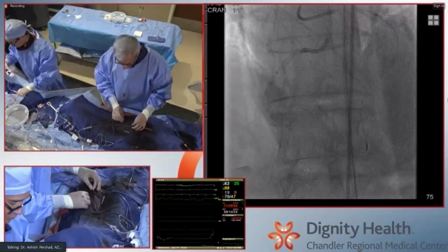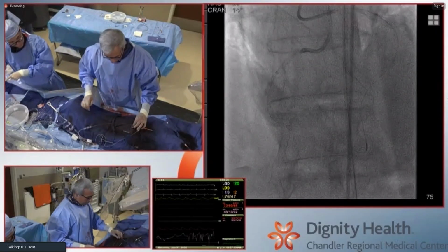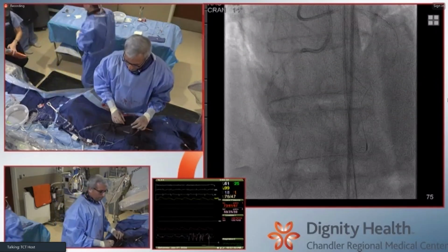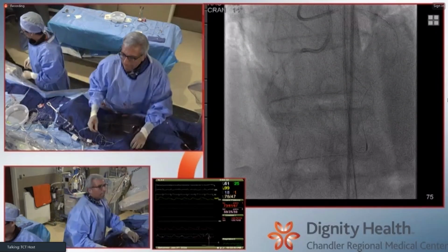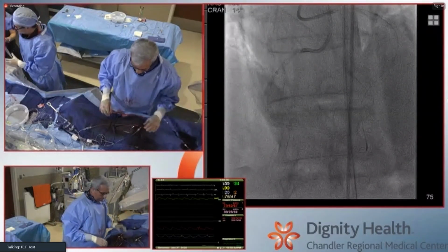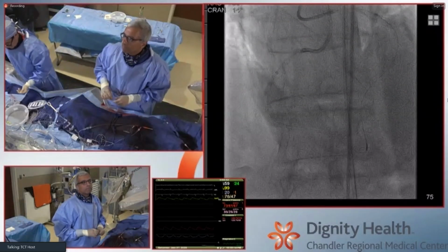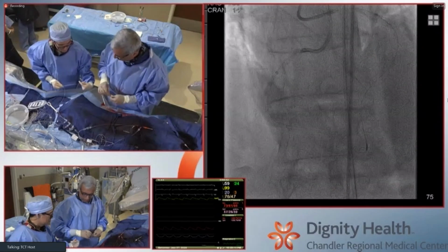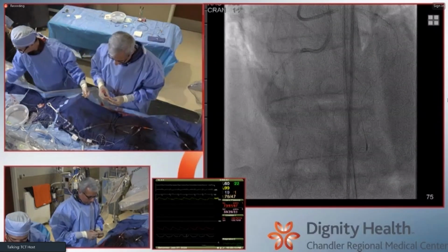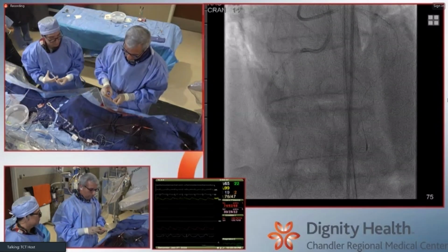there's nothing in here that's going to require IVL or really aggressive therapies within the CTO segment. Proximally, maybe, but we haven't really seen that in all that much detail yet. And frankly, IVL in this scenario, I'm not sure it's going to be all that helpful because you've got a very distensible side on one side. I think the simple, straightforward strategy here is the NC balloon, what has been taken, which is a simple long NC balloon where we observed full expansion and we move forward.